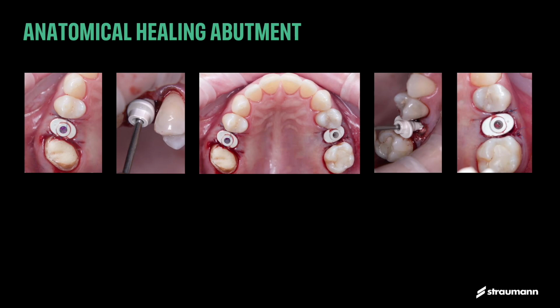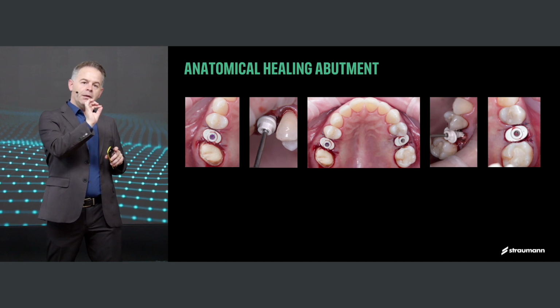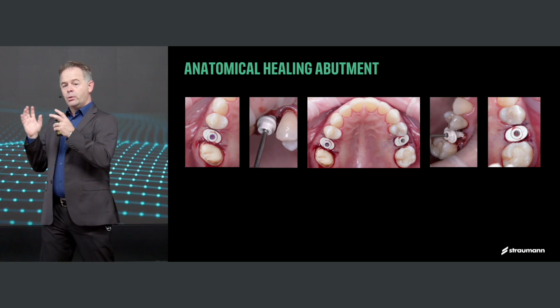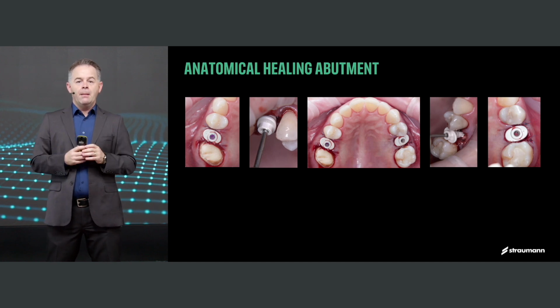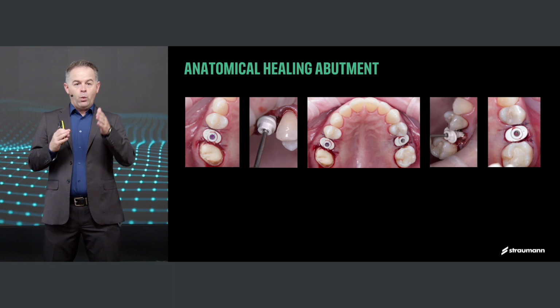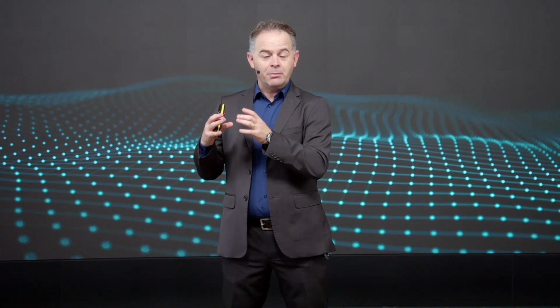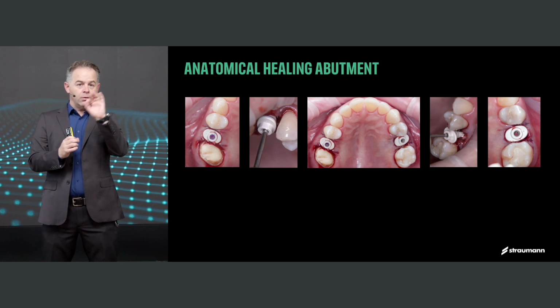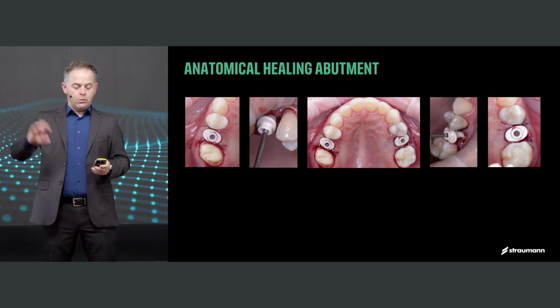Remember, already considered in the beginning in the planning, we placed the medium size healing abutment on tooth 15 and also on tooth 25. You see that it seals the socket very beautifully. But look how these two sides, even though very different, one had an incision and the other one was a flapless extraction with immediate implant placement. I was able to bring the tissue back and suture with single sutures mesial-distal on both sides, and this is how the patient goes home.